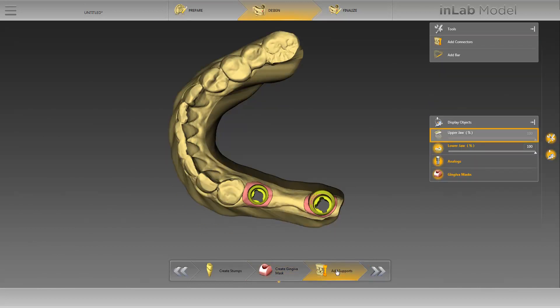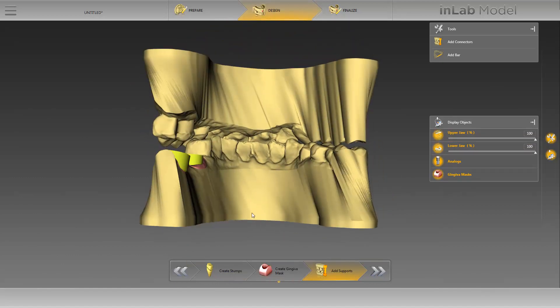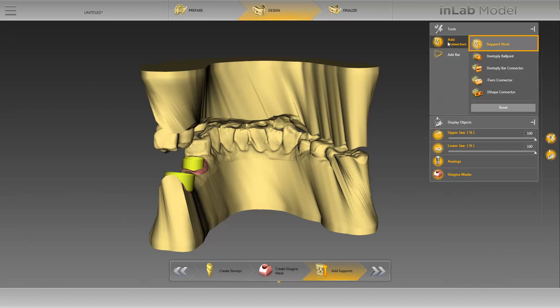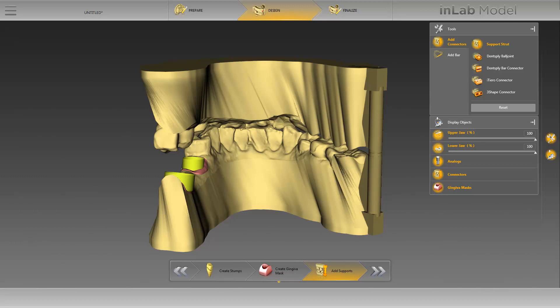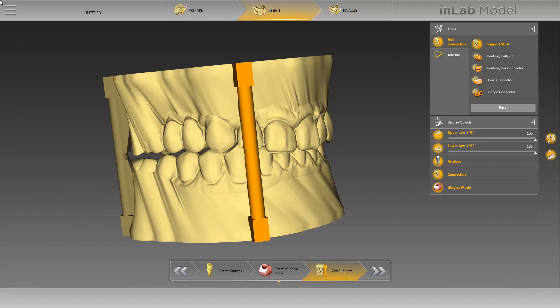First, we will activate our opposite jaw again and move our model to an ideal position. We have two tools available here. Since we want to set our models in a standard articulator, we forego placing a bar and just activate the Add Connectors option. Setting Support Struts makes it possible to safely keep the models together in final bite position. We move our cursor to the desired spot and determine the position by double clicking, and place a total of four support struts around the model.